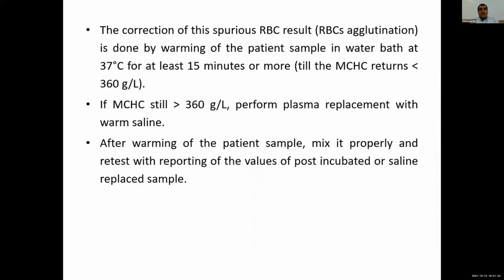How to correct this situation? The results of the CBC in presence of RBC's agglutination is spurious and cannot be reported as such. So we have to go for correction of these results. How can we achieve that one? The problem is due to cold agglutinin.